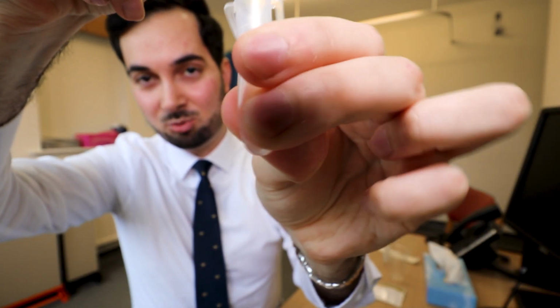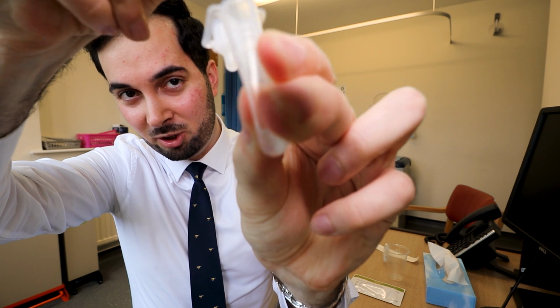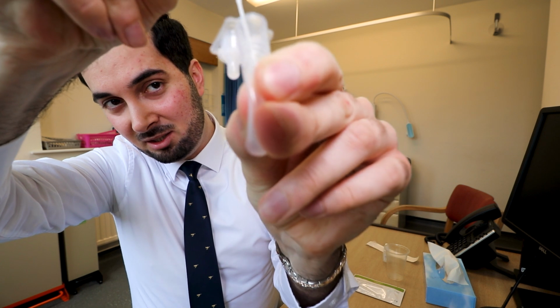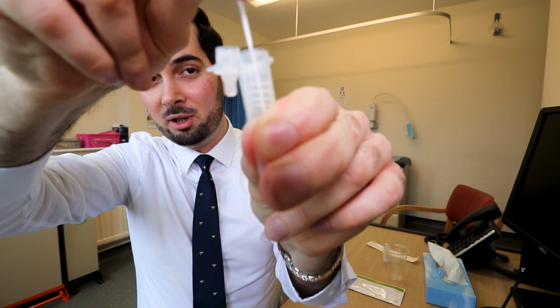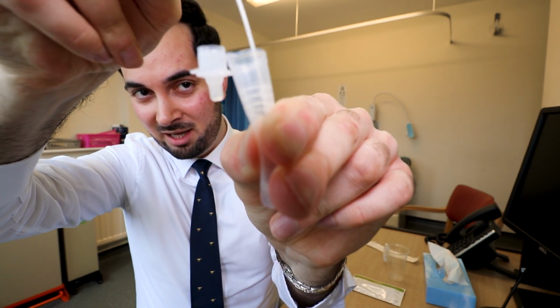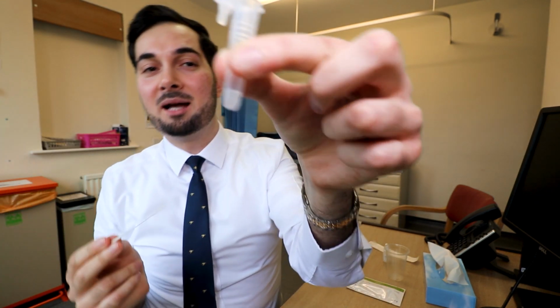You can squeeze these as well, so I don't know if you can see that. That just helps to get the stuff off it as well, so it all goes in that solution that we put in there earlier. You can push it up like so, pull it up like so, just to get everything off of it. So once you've done that, and it's all mixed in there nicely, pull it out, hold the edges so you can scrape any extra solution off it. The more you've got left, the better, because sometimes you're not left with too much. So that's all done. And with this, I'm just going to throw it away in my bin or in a plastic bag that you've got ready. So now that we've got this ready, we can move on to step number 11.